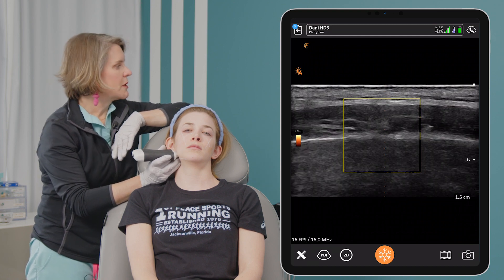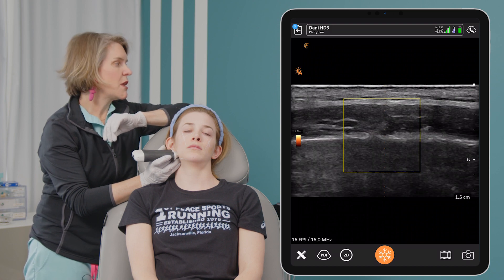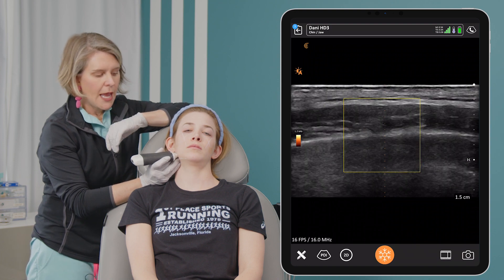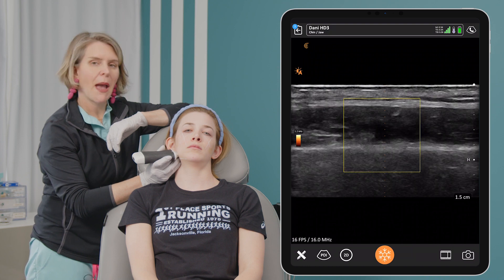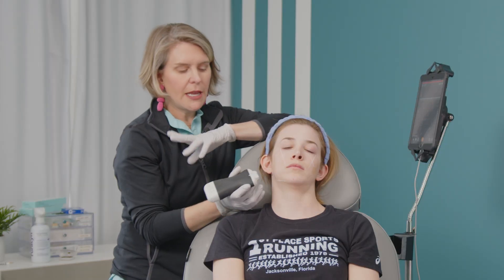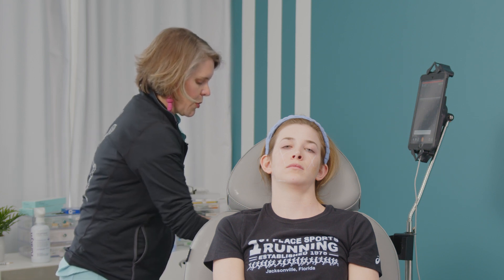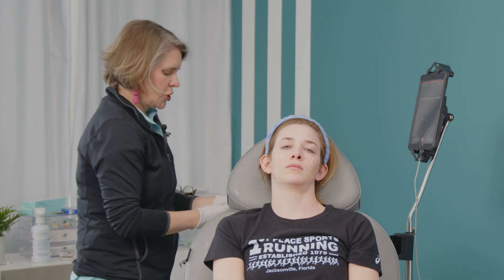So now we've checked all of our pressure, alignment, rotation, and tilt. Our midline marker is right on top of our surgical skin pen site. That is a successful safe map. I'd feel comfortable putting a needle bolus of any non-dissolvable filler or any HA filler here because I've taken a look. What I like to do is give one more alcohol wipe to the skin right on top of that dot, just to be sure.